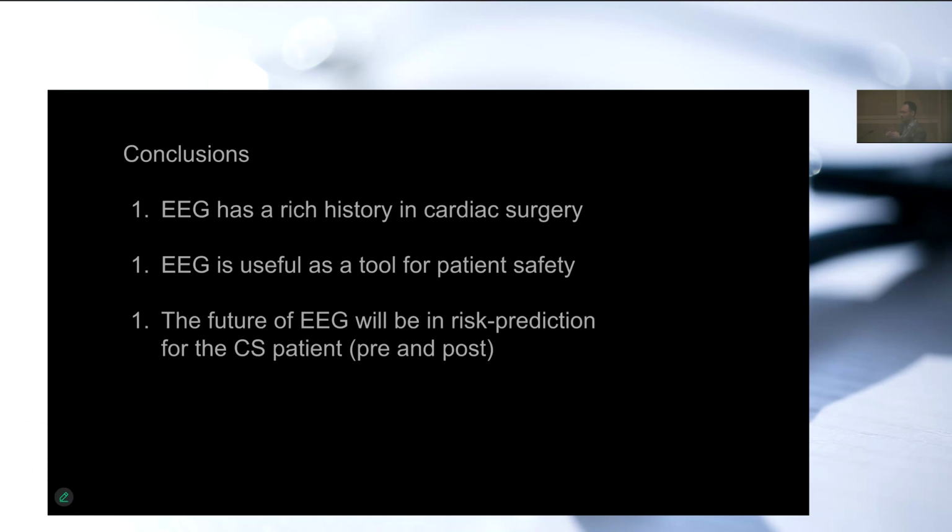Bryan, thank you for a wonderful presentation. My question, you've already partially answered, but it has to do more specifically with burst suppression intraoperatively relative to post-op delirium. I presume that all these studies that you have presented us were done in response to a quote-unquote standard anesthetic. And my question that I always have when I look at these EEGs intraoperatively is, is it the chicken or is it the egg? If I give enough anesthetic to anybody in this room, I can flatten their EEGs. That doesn't necessarily mean that they're at high risk or low risk. There's other variables. So how do you sort these things out?